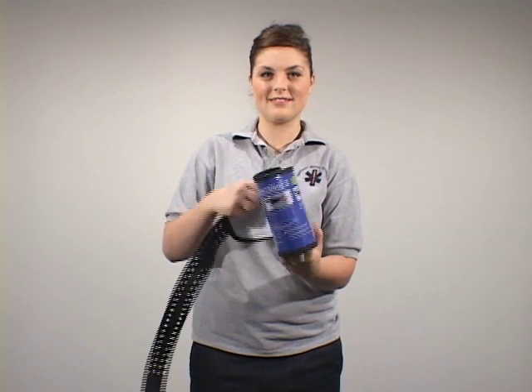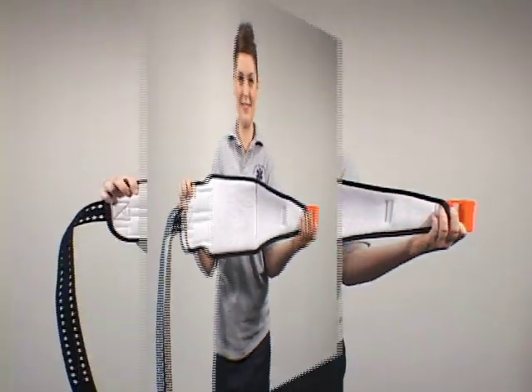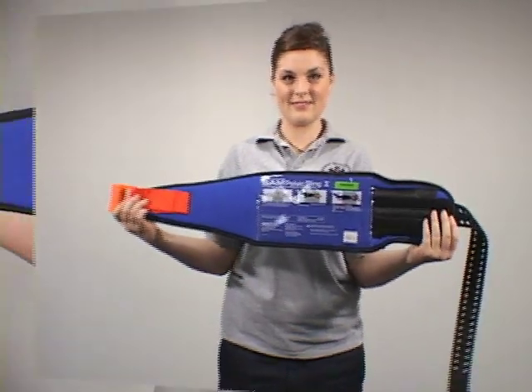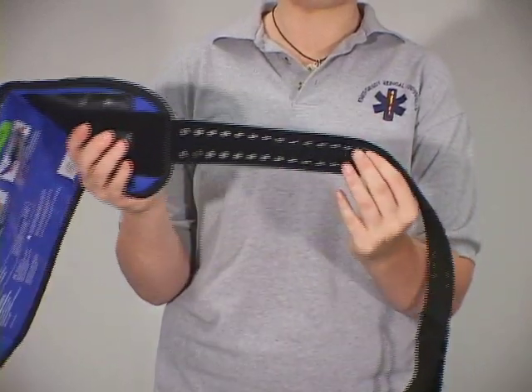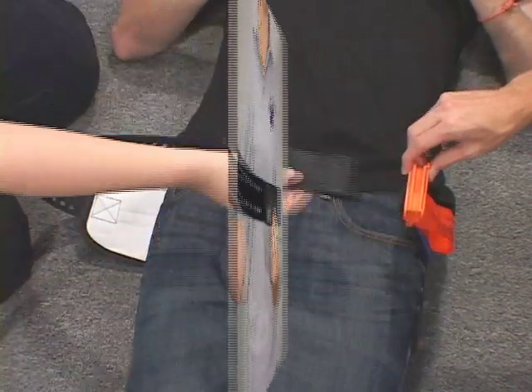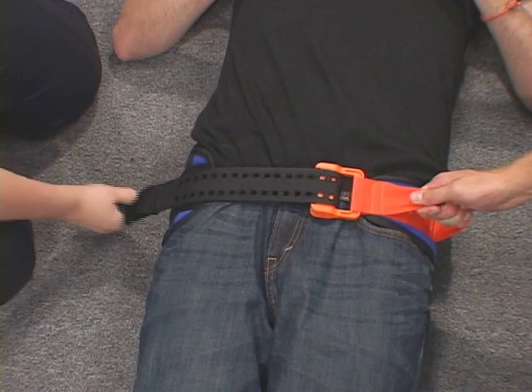The SAM Pelvic Sling 2. Its new one-piece design is easy to use, with application now in just three basic steps. The SAM Pelvic Sling 2 is the first and only force-controlled circumferential pelvic belt designed to provide safe and effective reduction and stabilization of pelvic fractures.